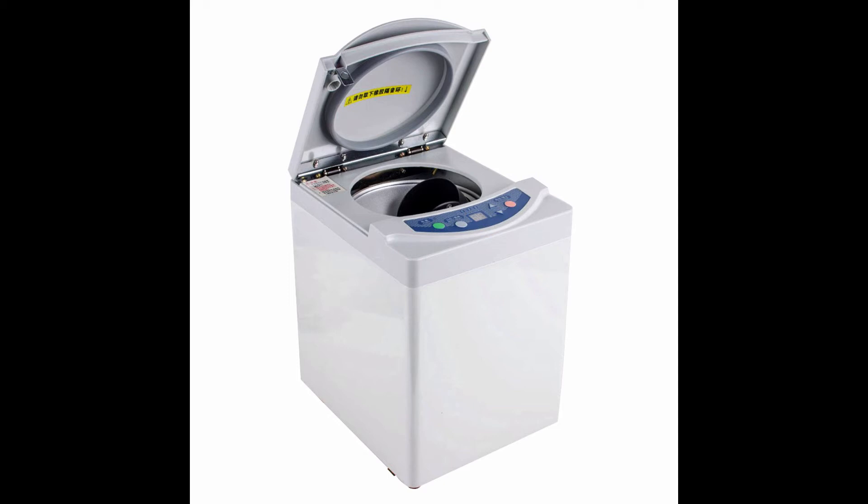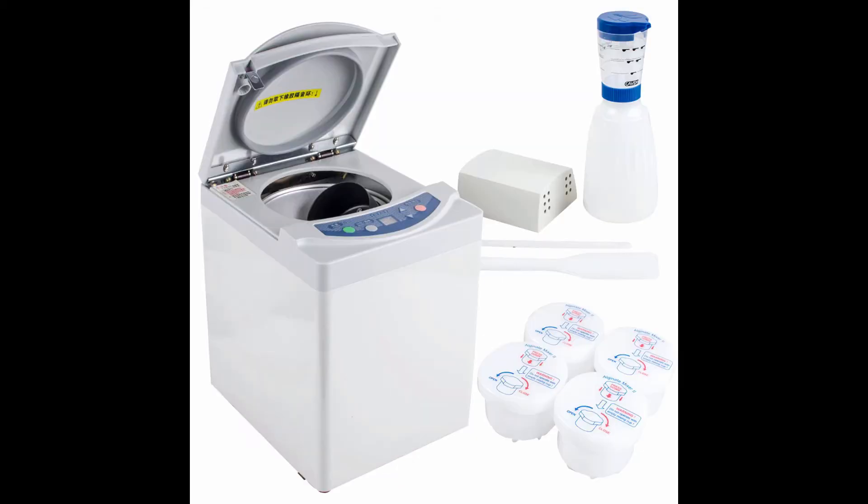Easy Operation: adopts high technology iCro computer control. Enjoy smooth mixture to gain the most accurate bubble and lump-free impression material, with low noise.